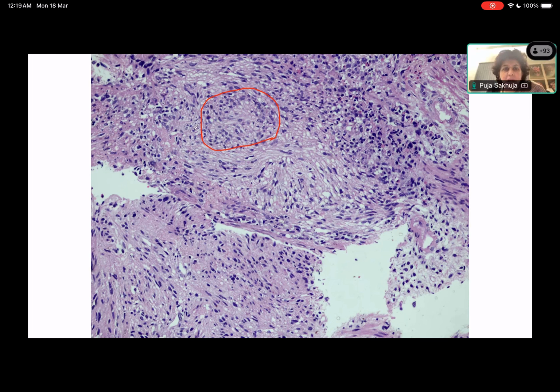Okay. So therefore, when it is cut transversely, it has an end-on appearance of the nucleus, and so it looks rounded. Because if the nucleus is spindle shaped like this, but then when it is cut like this, all you're going to see is the top of that, which is an end-on appearance, so it will look rounded. Correct. Now, would you like to describe the cytoplasm or something else? Anything else that you want to describe over here?